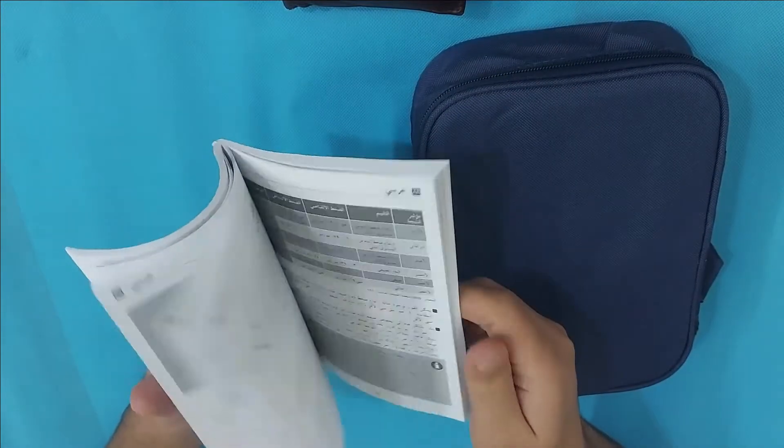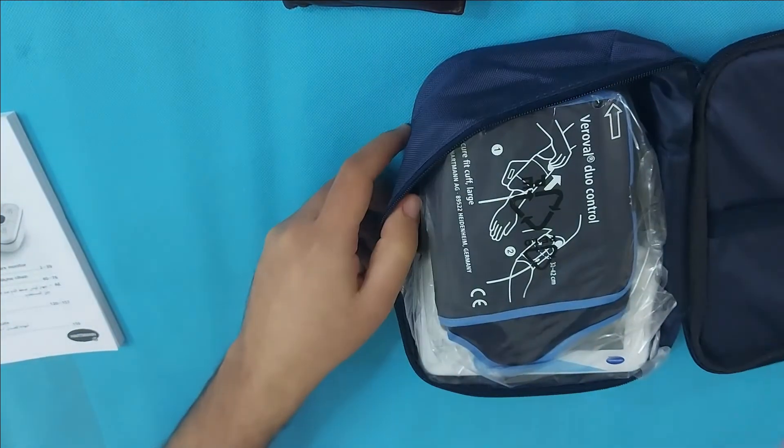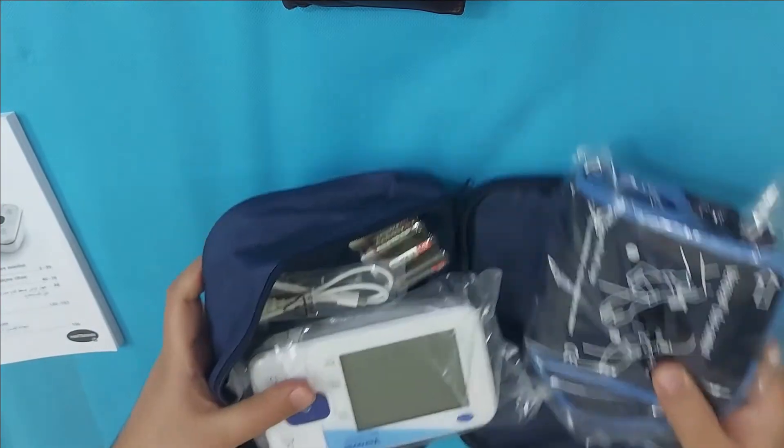You will get a guide manual after unboxing. Inside the carry pouch, there is an inflation cuff, the Hartmann Duo Control Blood Pressure Monitor, and battery cells for this device.